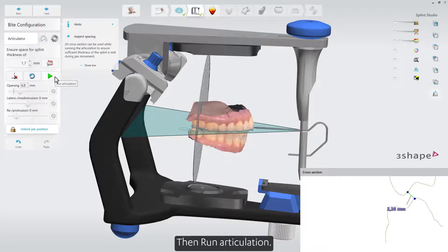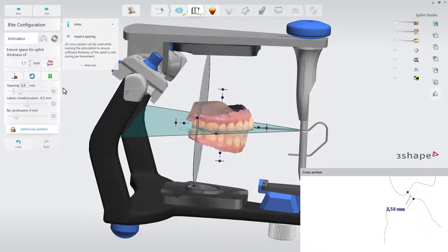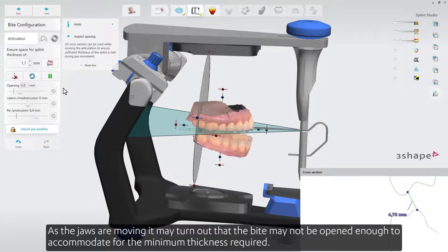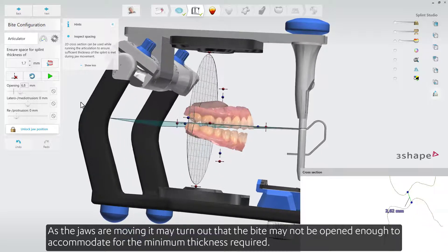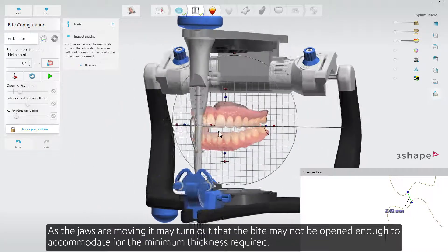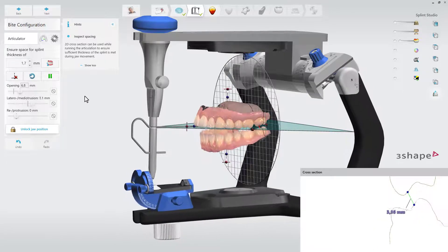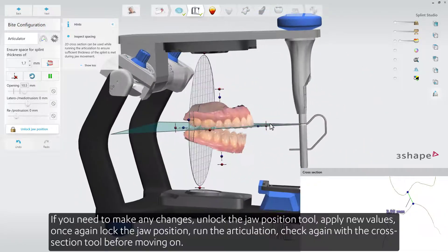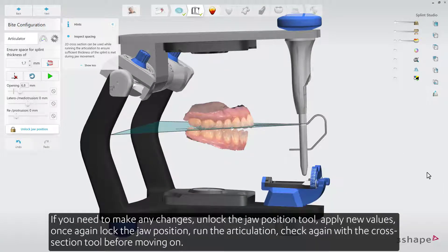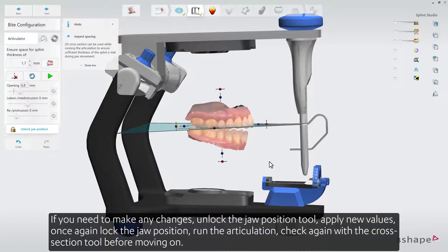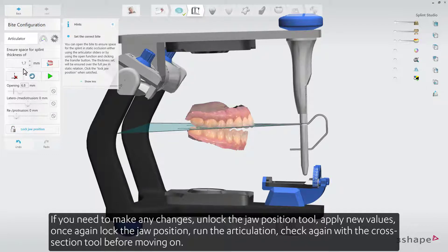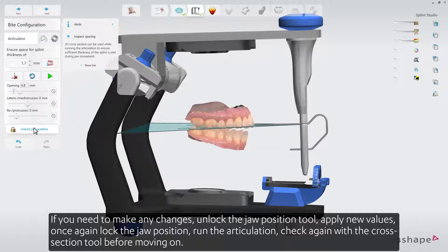Then run articulation. As the jaws are moving, it may turn out that the bite may not be opened enough to accommodate the minimum thickness required. If you need to make any changes, unlock the jaw position tool, apply new values, once again lock the jaw position, run the articulation, and check again with the cross-section tool before moving on.